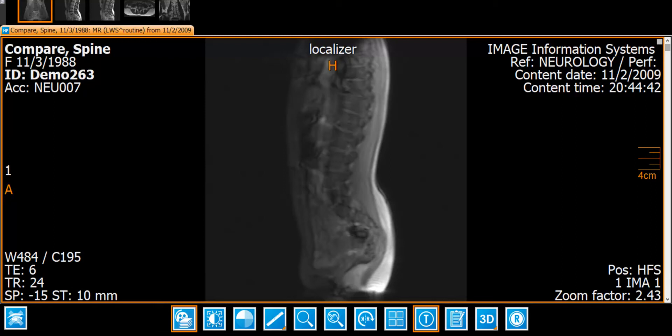Most radiologists read their images in dark rooms on dedicated workstations, for example iCUE View Pro. When closing a study from here, all the changes to hanging and layout will be lost, leading to a loss of time and effort on the radiologist's part.